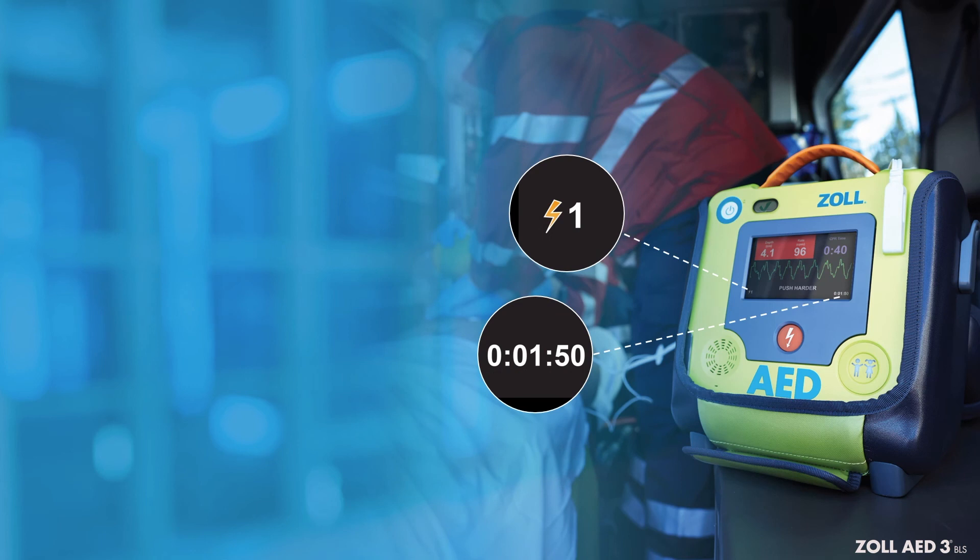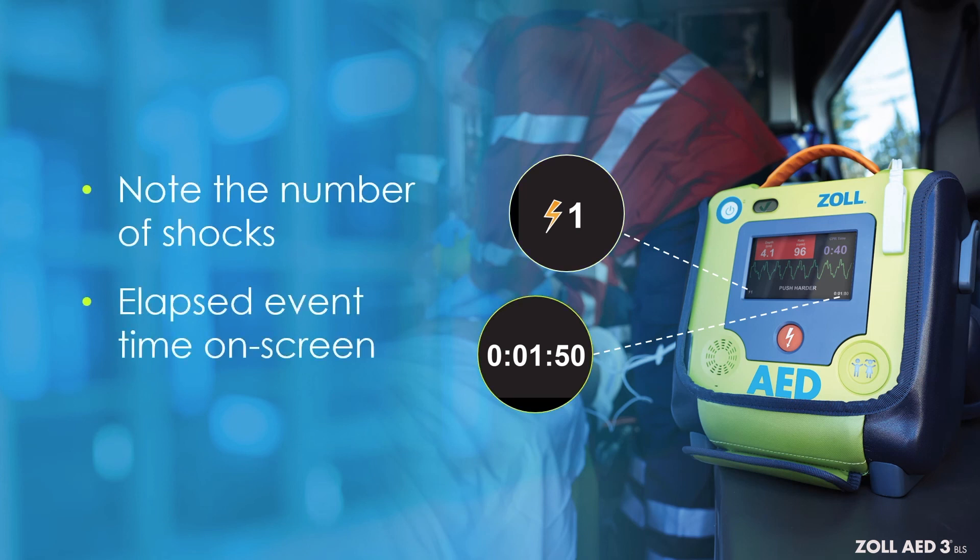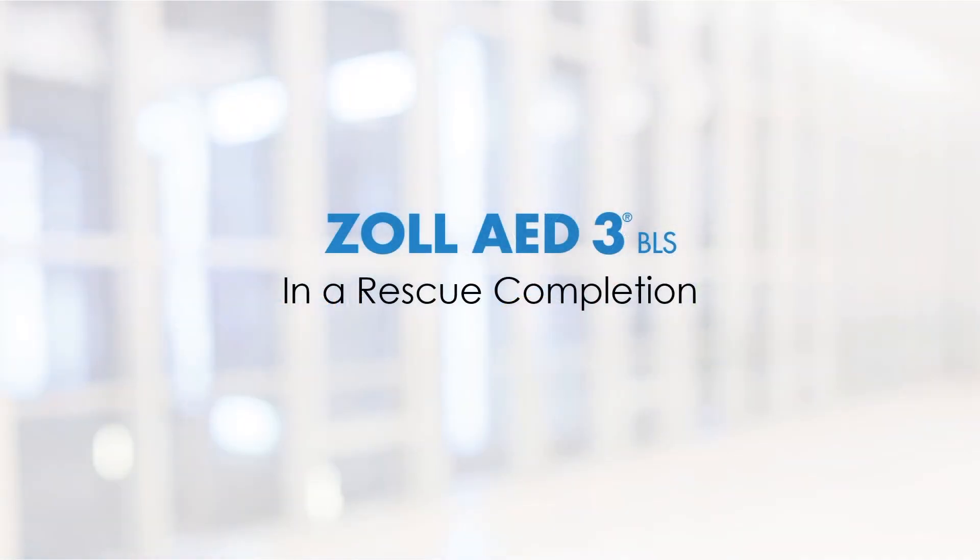If transferring the patient to another level of care, you can quickly note the number of shocks and the elapsed event time on the screen. You have completed the module that takes you step-by-step through a rescue with the Zoll AED-3BLS. Continue to the data transfer module.